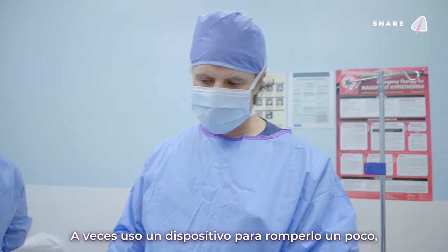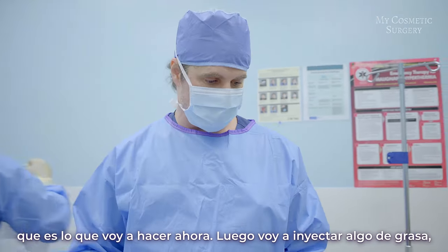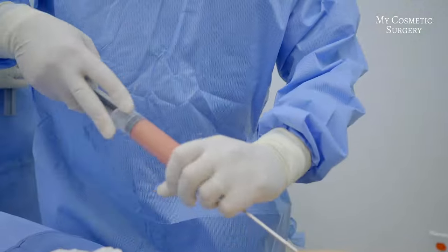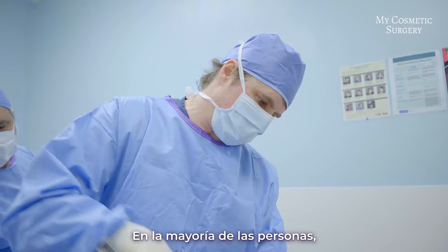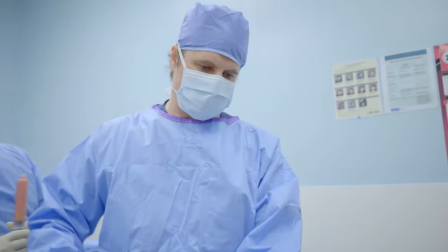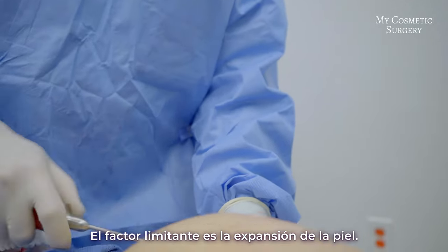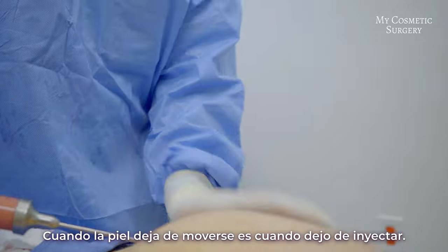Sometimes I use a device to try to break it up a little bit, which is what I'm doing now, and then I inject the fat to try to get it as round as possible and fill in the area for a nice round shape. Most people typically have around 40 to 50 percent of the fat survive, so we try to put in a little more than needed. The limiting factor is the expansion of the skin — when the skin stops moving is when I stop injecting.